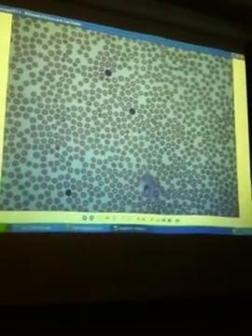This one down here, anybody, can you figure out what it is? Does anybody know? Neutrophil? Oh, the biggest, okay. So here's some good things. I'm glad we go through this. First of all, we will not see a basophil. They're the most rare. They're less than 1%, less than 0.1% of a healthy person's white blood cell count. So we're not going to find them. So that means that's never the answer. I will not trick you. It's not a monocyte. What this is, is a lymphocyte.